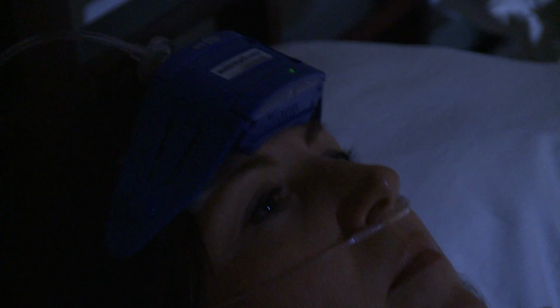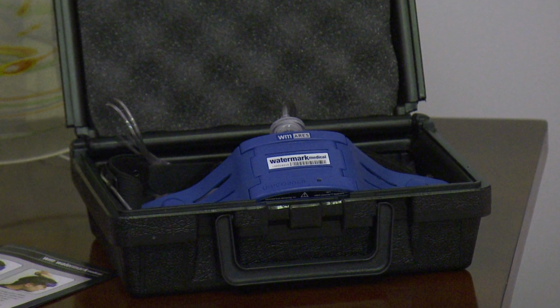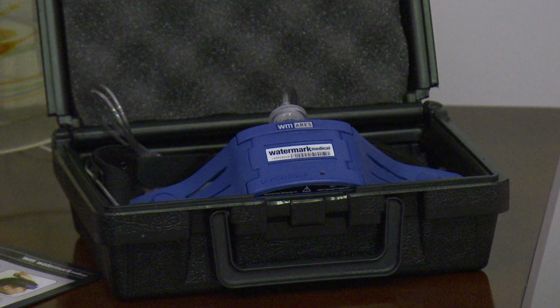It's downloaded into a computer. It prints out exactly what your sleep patterns were, the times that you were apneic or not apneic, and that data is sent to a pulmonologist who interprets it a little further, and we have a very standard, objective diagnosis of obstructive sleep apnea. Very easy.